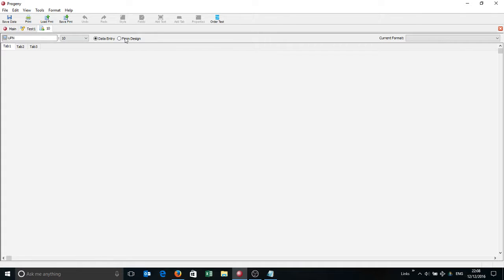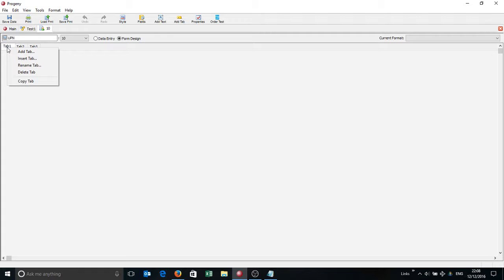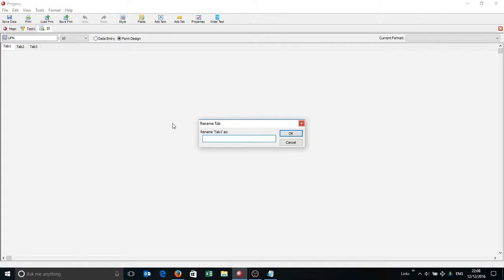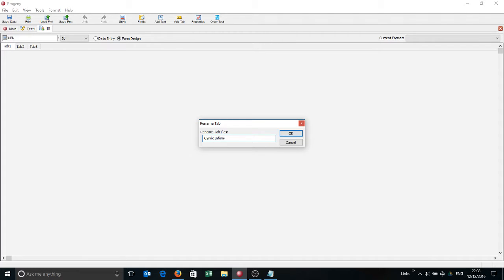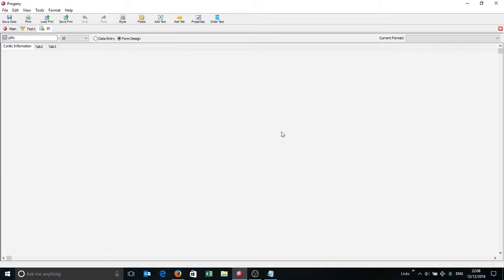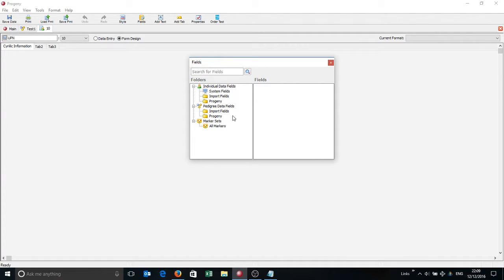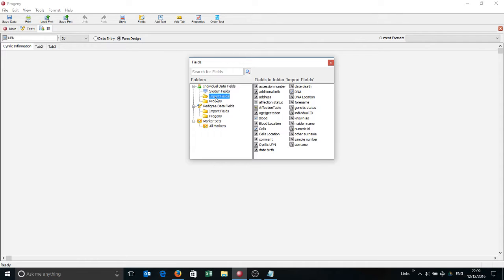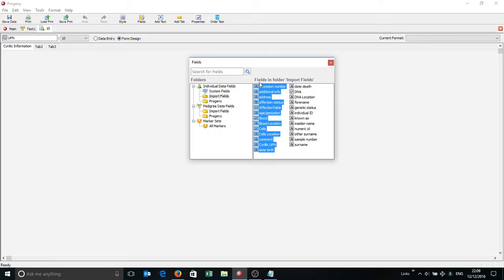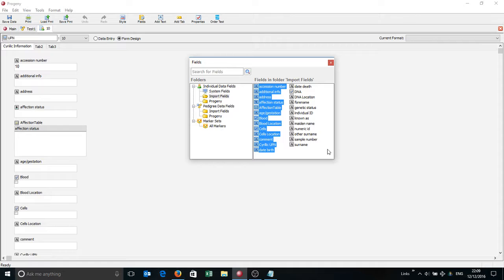So the first thing I'm going to do is left click on Form Design, I'm simply going to rename this tab Cyrillic Information, like so. And then I'm going to left click on the Fields tab at the top here, and this will show me all the fields that are in Progeny. The fields and information that I just imported from Cyrillic is here in this Import folder. I'm going to just lasso the left hand, left click and just drag these into position.